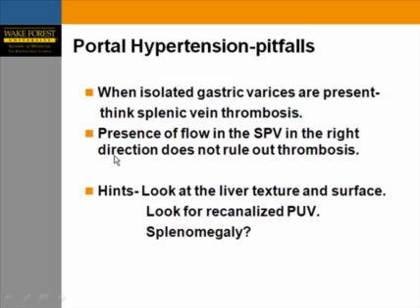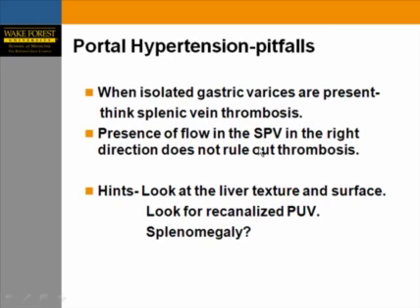Also remember: isolated gastric varices should make you think of splenic vein thrombosis rather than portal hypertension. Ultrasound is not a great tool to evaluate the full length of the splenic vein, so normal flow in the splenic vein does not exclude splenic vein thrombosis. Always look for hints: nodular liver texture indicates cirrhosis; look for recanalized periumbilical vein and splenomegaly.